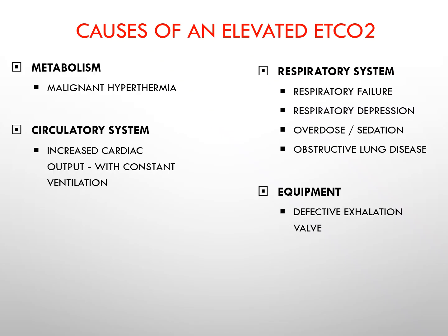And there's always the chance that there's equipment failure, so a defective exhalation valve on, let's say, a single limb circuit. We don't see them real often, but we do see single limb circuits used with certain BiPAP setups, non-invasive setups. For instance, the Trilogy ventilator slash BiPAP can use a single limb circuit, and that exhalation valve can become defective, or secretions could clog it up, something along those lines, which could absolutely cause the patient to rebreathe CO2, with an elevated capnographic waveform and numeric value.